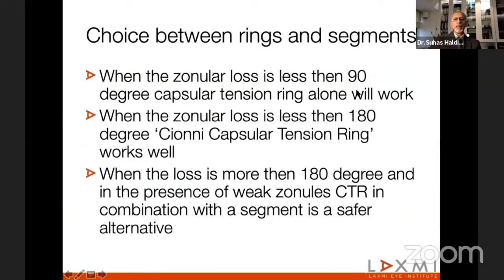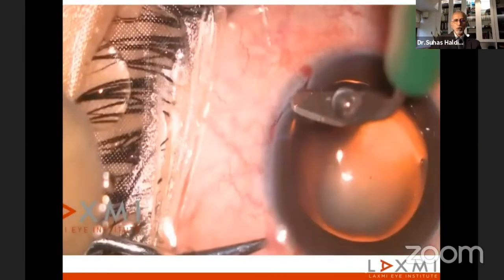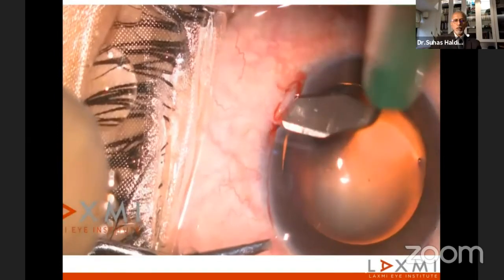So the choice between rings and segments: when the zonular loss is less than 90 degrees, a capsular tension ring alone will work. When the zonular loss is less than 180 degrees, Cionni's capsular tension ring works well. But when the loss is more than 180 degrees, like in this case, in the presence of weak zonules, a CTR in combination with a segment is a safe alternative. Now, in this case, there are extremely weak zonules. I have already planned to go for a segment.